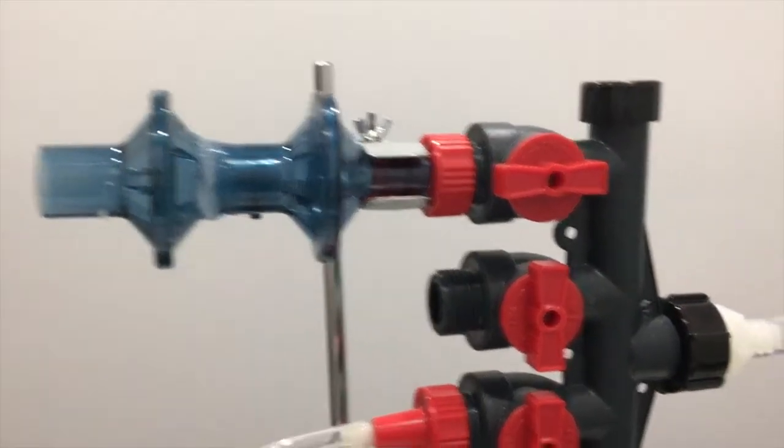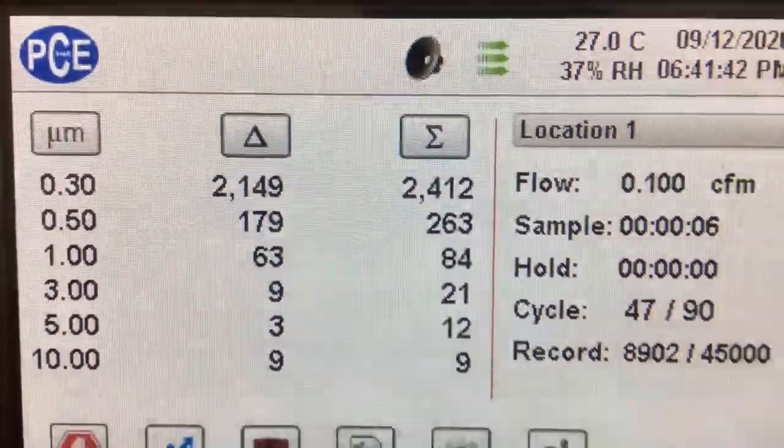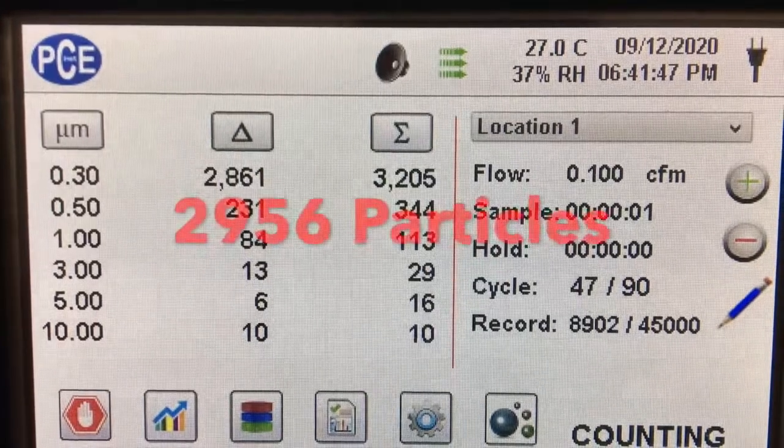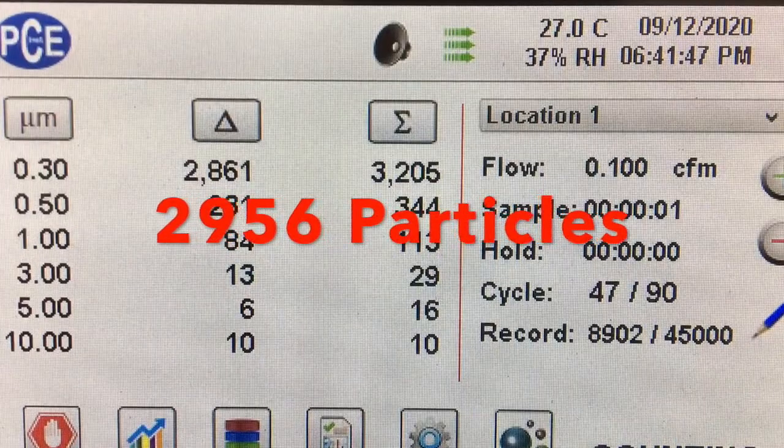This is a video of us testing the air so that we could have a comparison and we could calculate the filtration efficiency. We got an average particle count of 2,956 particles over 90 trials in the 0.3 micron channel.